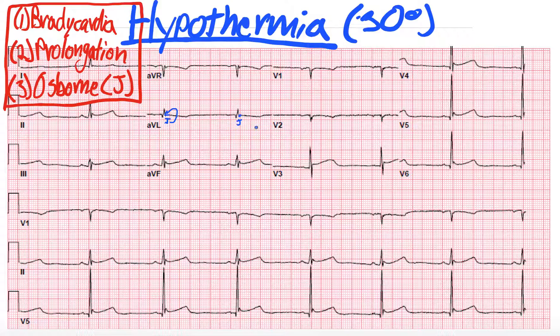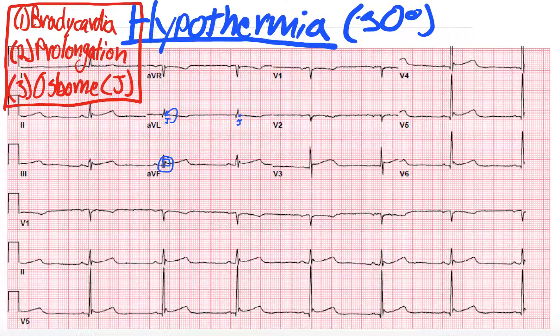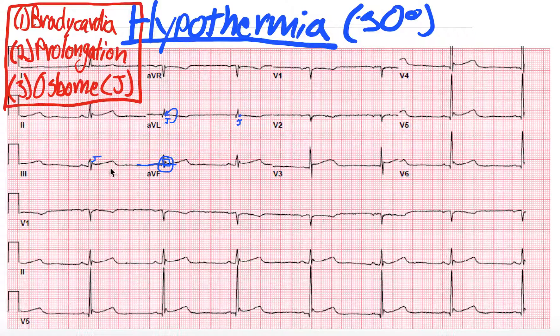The J point in different conditions can be elevated, but hypothermia tends to be the condition we talk most about. So what is a J point elevation, a J wave, or an Osborne wave? If we go down to lead three and AVF, we can see this elevation right here — I'll put a square around the actual elevation. That is the J point popping up. The J point elevation is above the isoelectric line, and we see this J point peeking out above the isoelectric line.